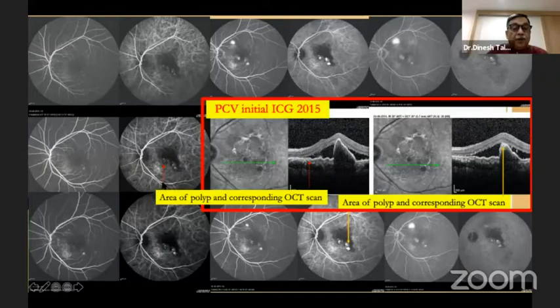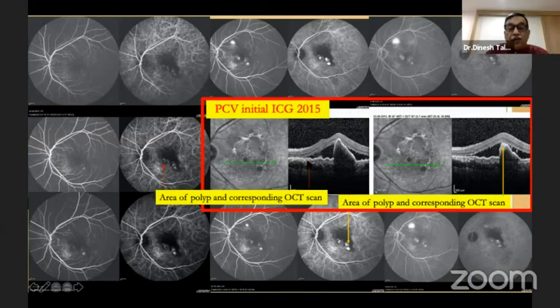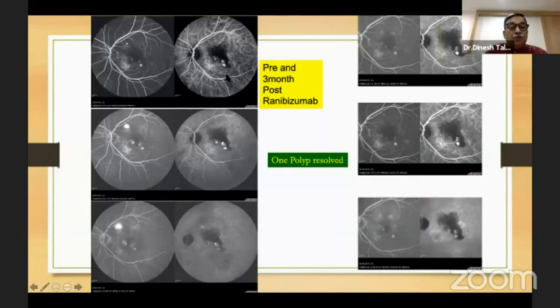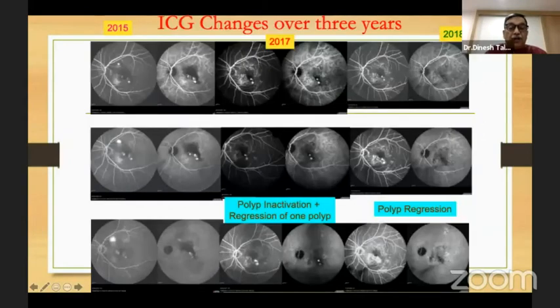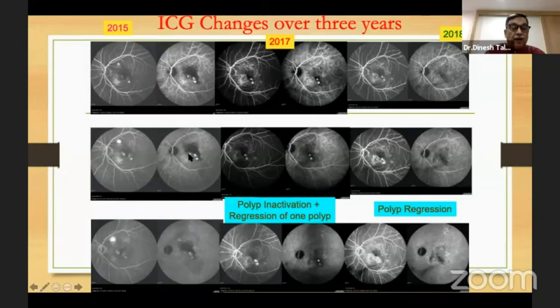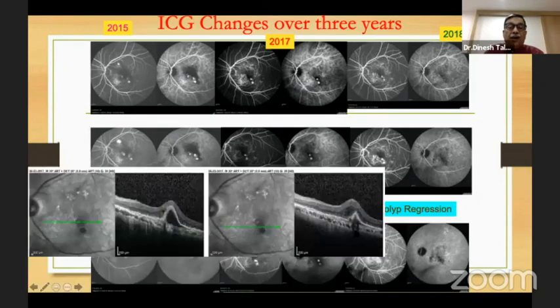You can characterize the OCT changes with the ICG changes — where you see the polyp on ICG, you can also see it on OCT. The initial lesion showed multiple polyps on ICG. In the second visit, one of those polyps had resolved while two were still present — partial resolution. By 2017, polyps had become inactivated with no fluid on OCT, though regression was only of one polyp. But by 2018, all of them had regressed.